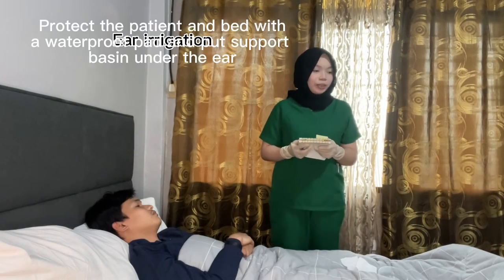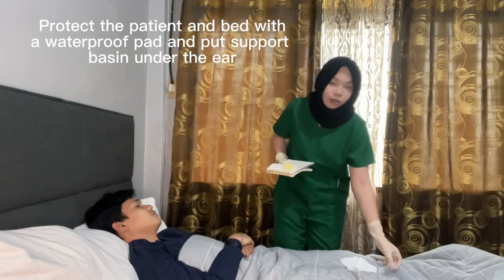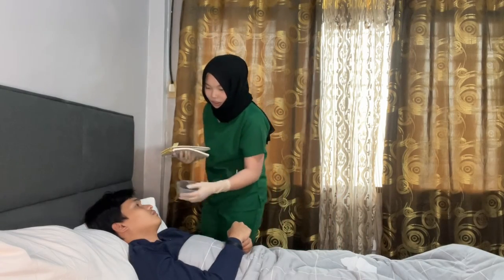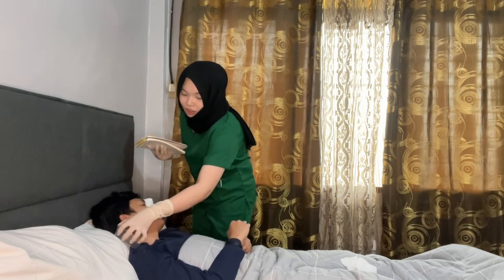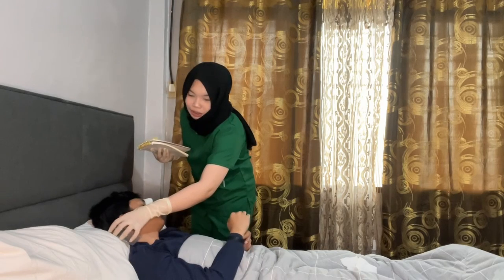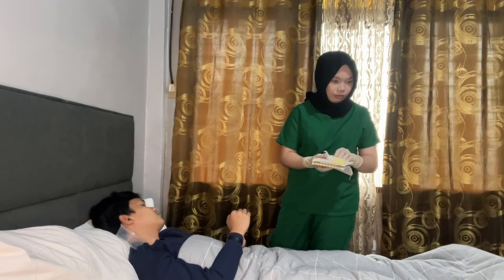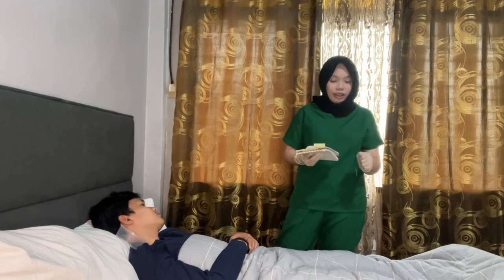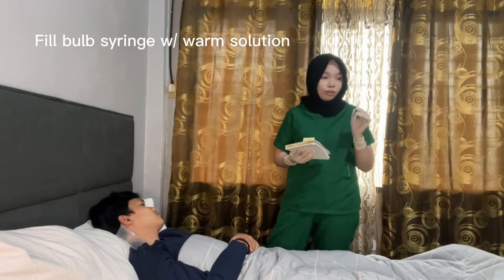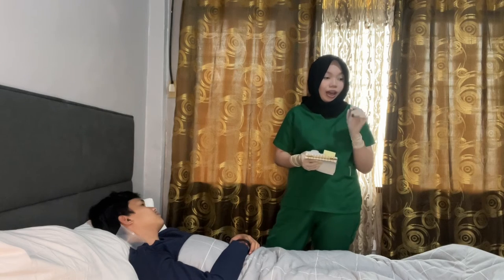For ear irrigation, protect the patient and the bed with a waterproof pad and place a basin under the ear to collect the irrigating solution and prevent soiling the patient. Let's assume this is a waterproof pad. Fill the bulb of the syringe with warm solution. If an irrigating container is used, prime the tubing. Let's assume the syringe is filled with warm solution.